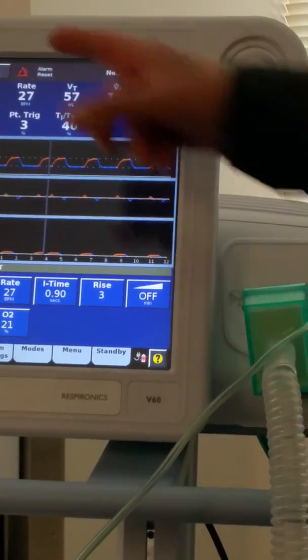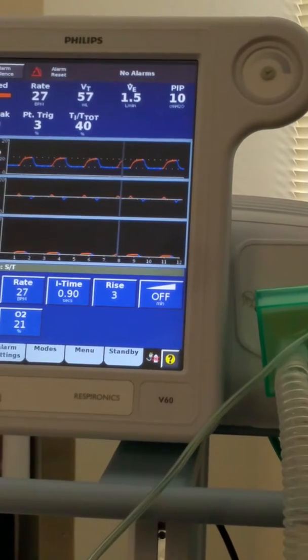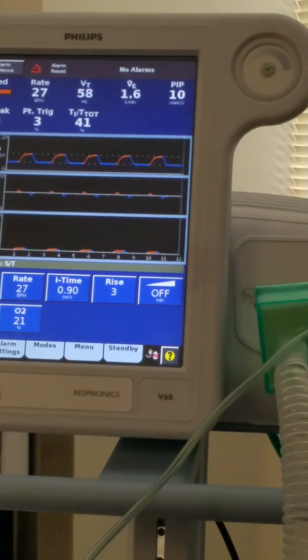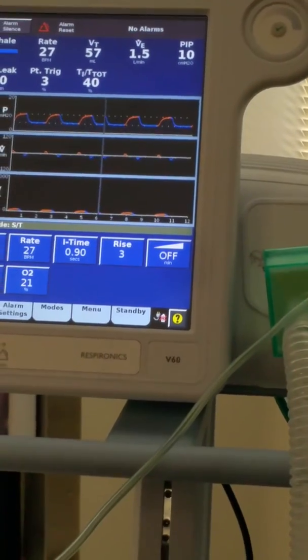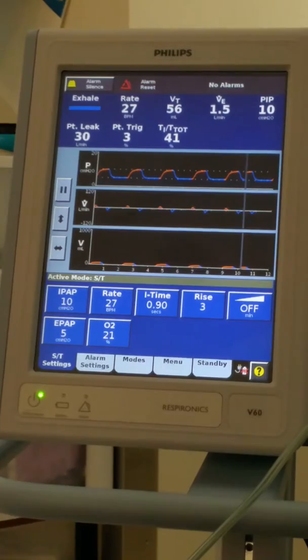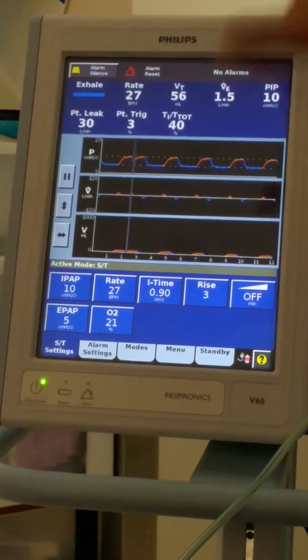Now, what's going to make us want to give him more breaths or less breaths? Blow off CO2, and we're going to get that information from the ABG. So the ABG is such an important issue. Now, I might not know the ABG. What's going to be a good indicator of what his CO2 may be? His demeanor, I guess. He's hypoventilating.